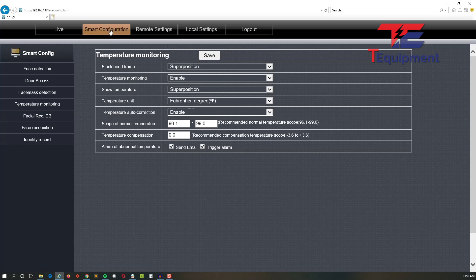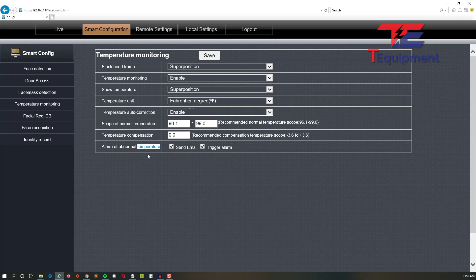And you're going to go ahead and check off the 'send email alarm for abnormal temperature.' This is where you're going to be detecting that. And this will allow you to actually trigger the SMTP server we set up with the email that there's been an abnormal temperature detected. You want to trigger the alarm, this is where that's done.